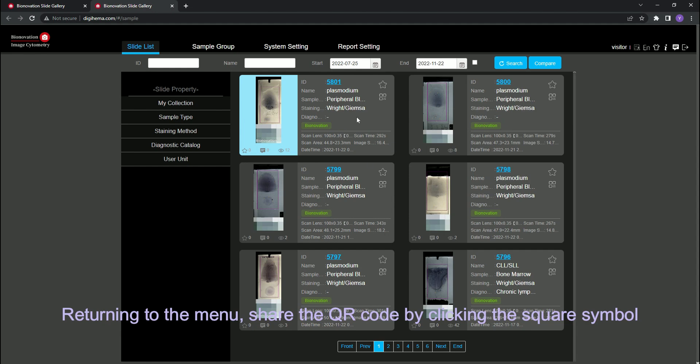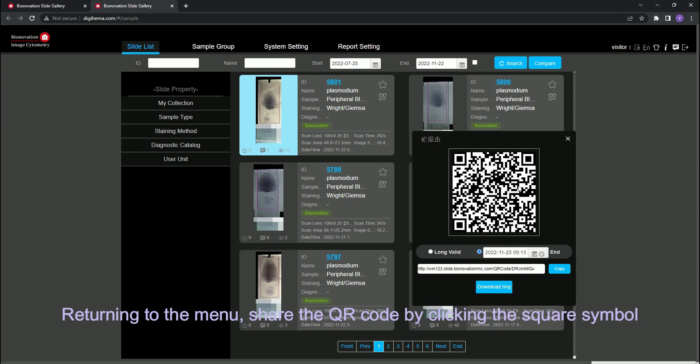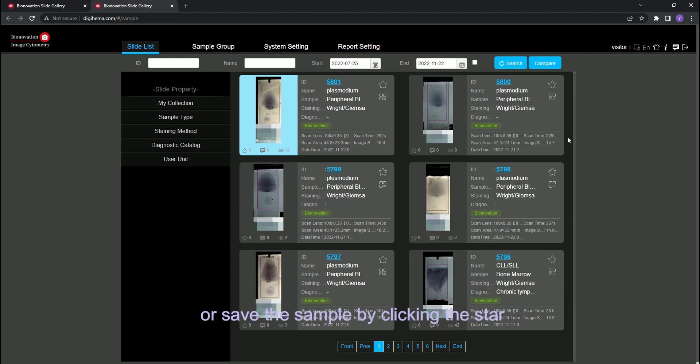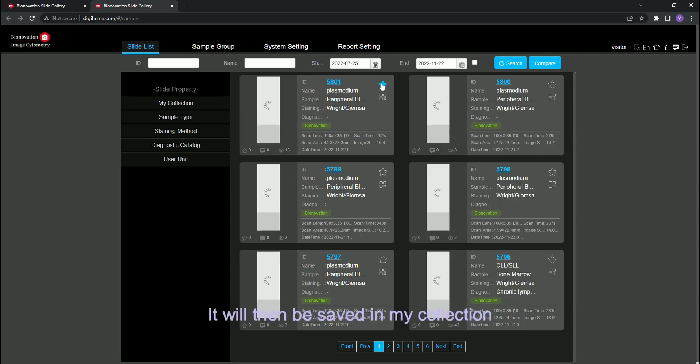Returning to the menu, you can share the QR code by clicking the square symbol or save the sample by clicking the star. It will be saved in my collection.